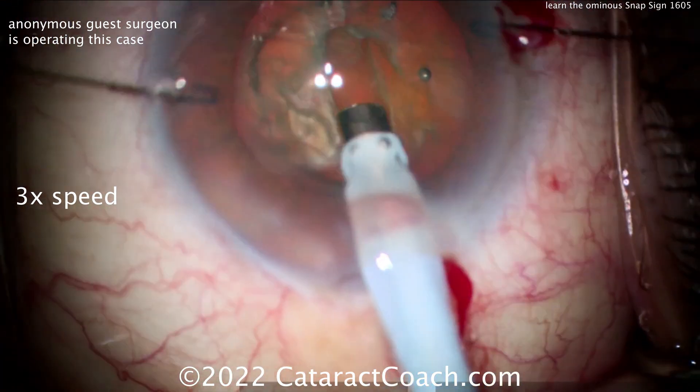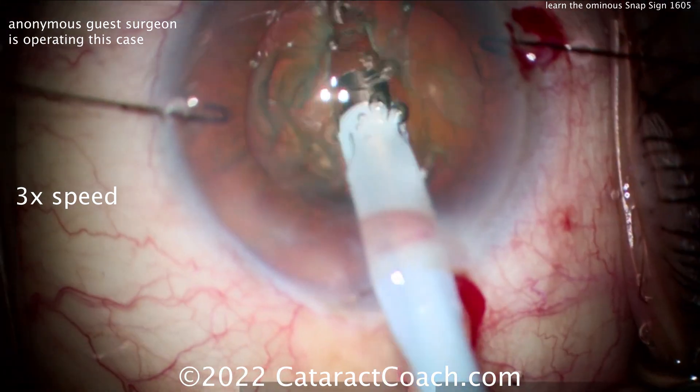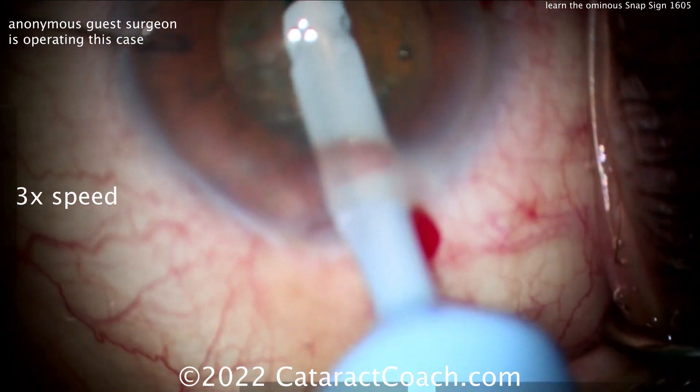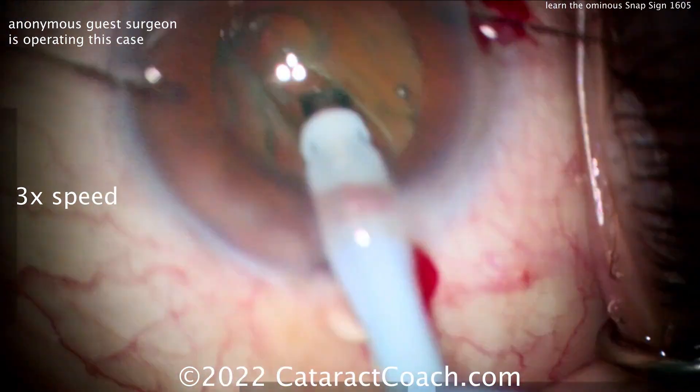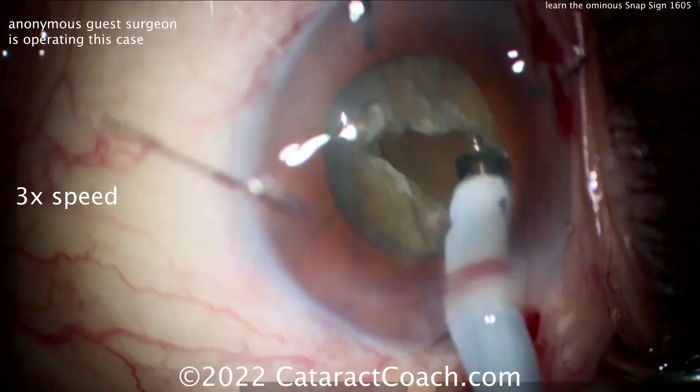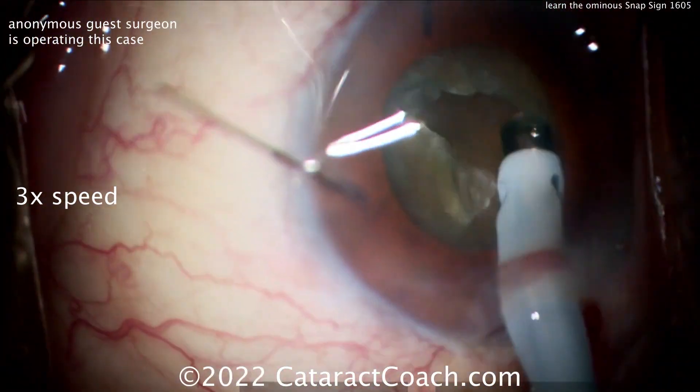The surgeon is proceeding here now with the phaco probe, trying to sculpt a groove down the middle. It looks okay for now because there is some support still, but the posterior capsule in essence is just wide open. You can see the surgeon has also put in some iris hooks to be on the safe side in case the pupil starts to come down.